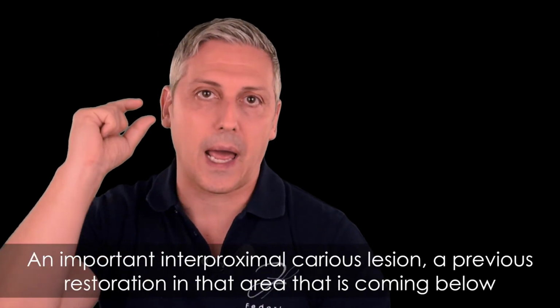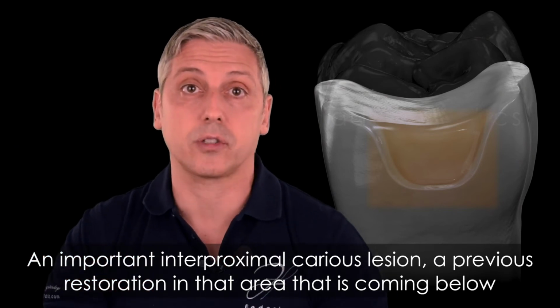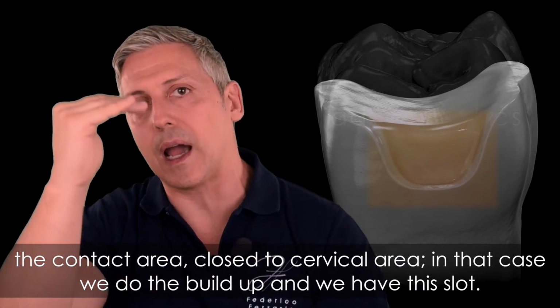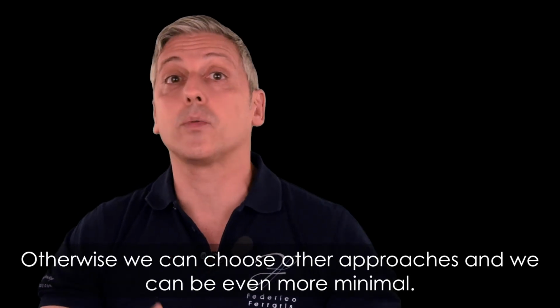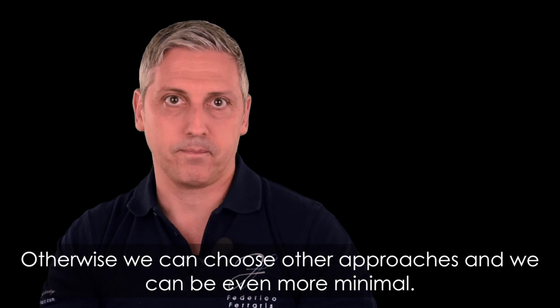An important carious lesion, an interproximal carious lesion, a previous restoration in that area that is coming below the contact area, close to the cervical area. Okay? In that case, we do the build-up and we have this slot. Otherwise, we can choose other approaches and we can be even more minimal.